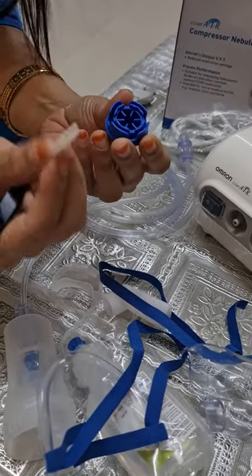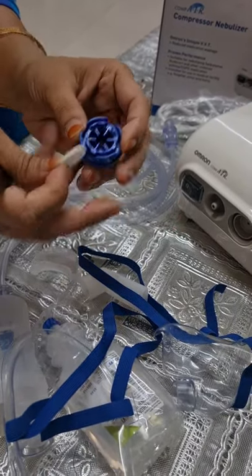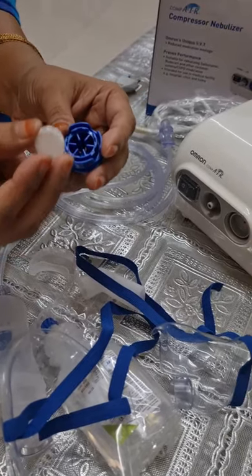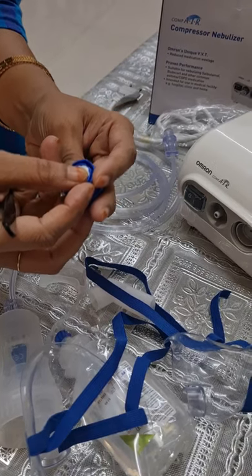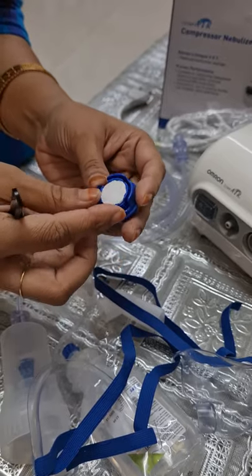The filter replacement schedule depends completely on usage. If you are using it regularly, change it every 60 days. If you are not using it frequently, then you can keep it for more like four to five months before replacing it, depending on whether it looks dusty or has black particles.